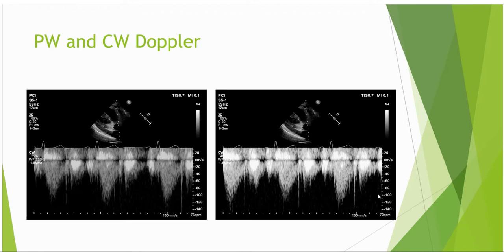Dynamic range, if adjusted to higher levels, will add more shades of grey to a weak signal and may make it easier to fill in a flow profile so a VTI can be accurately traced or the peak velocity best determined. There may be limited benefit of adjusting the setting when a strong signal is displayed on the trace, in which instance a lower setting may enhance the strong signal's flow profile edge.